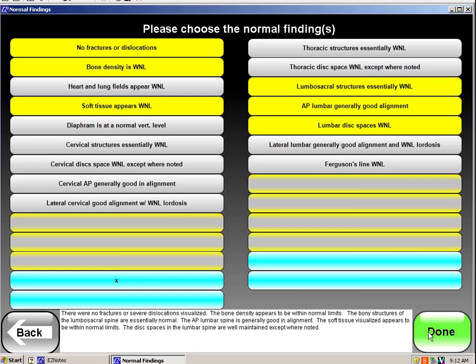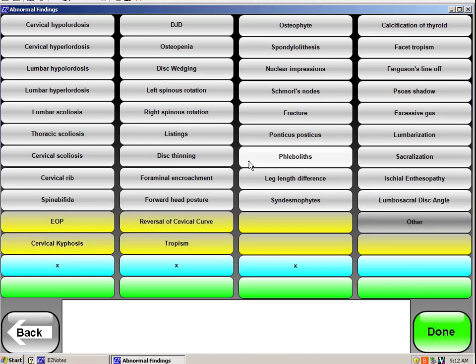It moves me to what might be abnormal in these pictures. So again, I'm just looking at what I found. So let's say there's a leg length difference. If I click on where it says leg length difference, and I draw my lines.